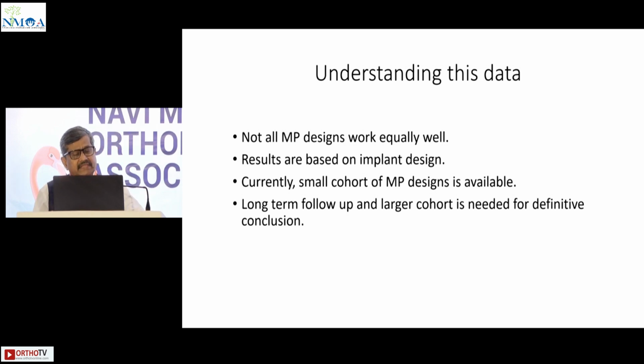Now, this means that not all MP designs work equally well. The results are definitely based on implant design. Currently, there is a very small cohort of medial pivot designs available, and long-term follow-up and a larger cohort is definitely needed for definitive conclusions.